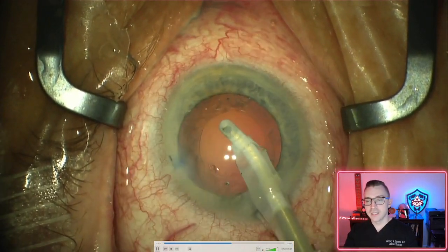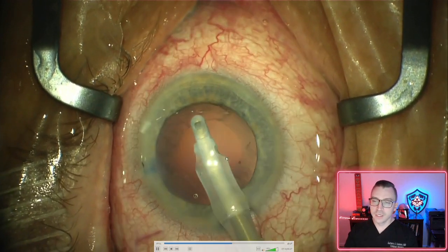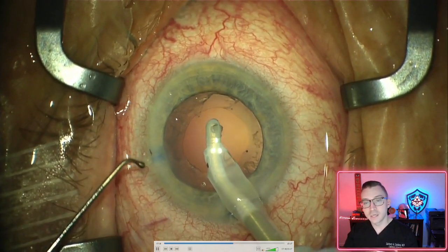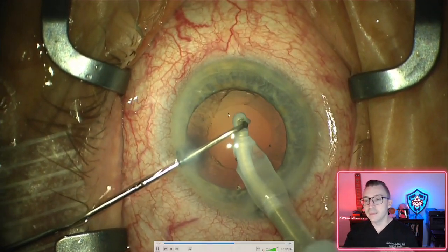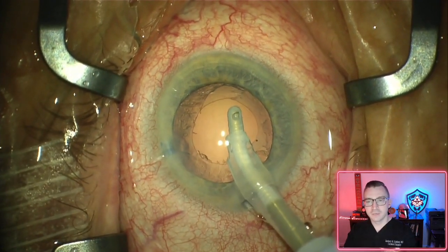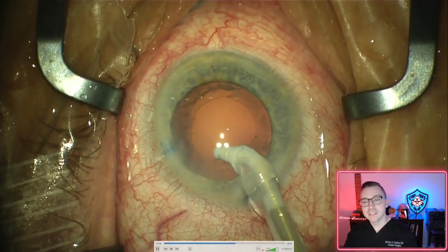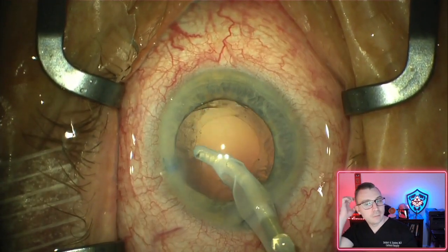So now I'm actually taking another handpiece here. This has an irrigation port right here, and an aspiration port, a suction port here. I'm going to use that to suction off the last bit of this cataract material here. This is that cortex material I was telling you guys about earlier. If you leave this in the eye, it's going to cause some inflammation. It's going to be very difficult to control. Patient has to be on steroids for a long time, and you would get a lot of haziness that forms in the back of the capsule here, forming what's called a posterior capsular opacification.